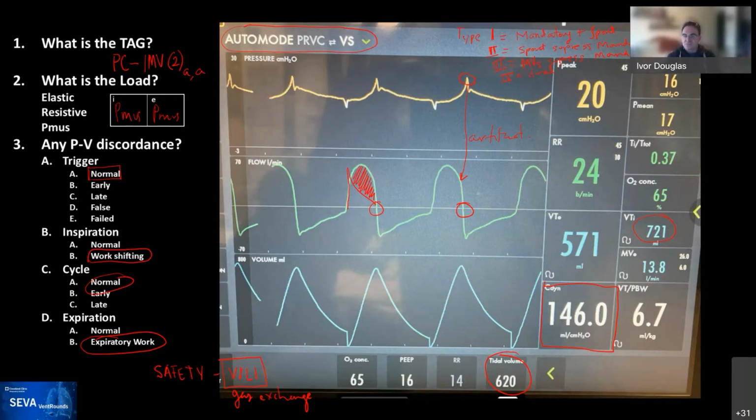Yeah. We have struggled so much. I don't know what your experience is with it. We have been looking for a good way to set up bilevel at high levels and have them synchronous, achieving our goals with these patients. But we're open to learn. So if you let us know, but definitely I do agree with you. If you push all the way up and the diaphragm cannot move, then that will limit the excursion of the lungs and achieve recruitment, as long as the patient doesn't do any effort.